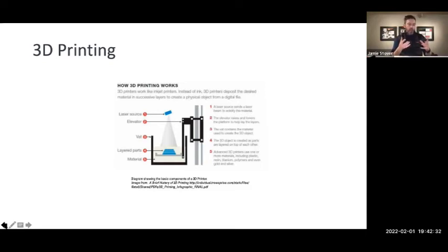You have your design file and you send that to some special CAM software, and it slices that file. If you want to print something that looks like this, you have a file that looks basically like this. It has all these properties and this shape and these dimensions. And then the software is going to break that up into a bunch of slices. And then it's going to play each one of those individual slices on the underside of that glass.